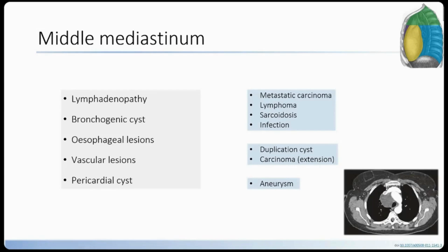But I think it's an important bit, isn't it, in terms of the middle mediastinum, it's the bits that we more commonly encounter in a lung or pulmonary specific context, in terms of mediastinal lymph nodes, whether that be a lymphoma, reactive nodes, or metastatic carcinoma. So that's very much in that bag, and we won't really touch on them much further. So nodes, cysts, and things connected to an airway or a GI tract, and that's a fairly typical appearance of a bronchogenic cyst on CT scan.